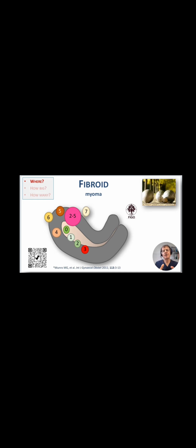When you see a fibroid, first you have to know it's a fibroid. Once you see a fibroid, the three questions you have to answer are: where is the fibroid, how big is it, and how many fibroids do you see? For the first question, where is the fibroid, we use the FIGO classification 0, 1, 2, 3 to 7. That's important, especially if you want to remove it, to see if it is in the cavity, in the wall, or protruding outside the uterus.